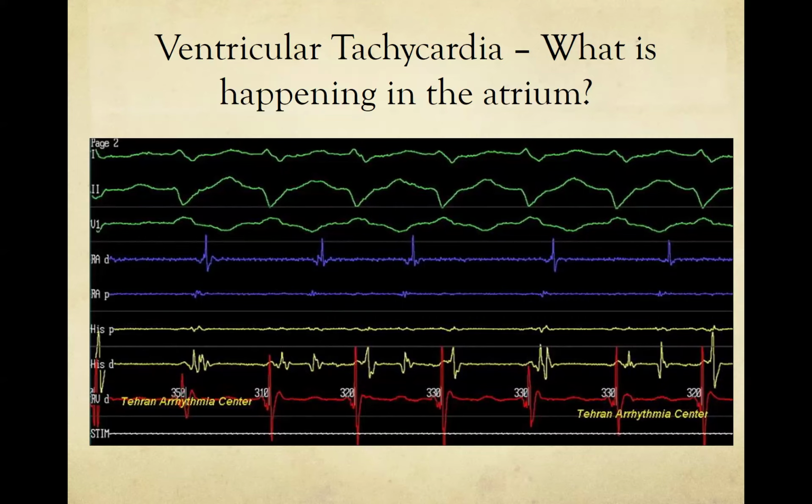Any questions for anybody? I have a quick question, more from a logistics standpoint. What is the utility of having the right atrium distal catheter and the RA proximal catheter? It's a good question. Honestly, I don't know, Ivana. I guess if you thought that the pathway or whatever you were ablating was near that catheter, you might want to see which of those two was earlier.